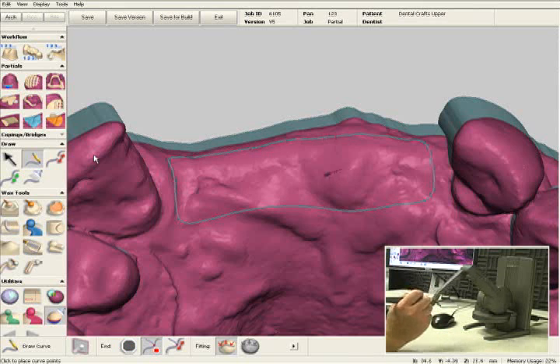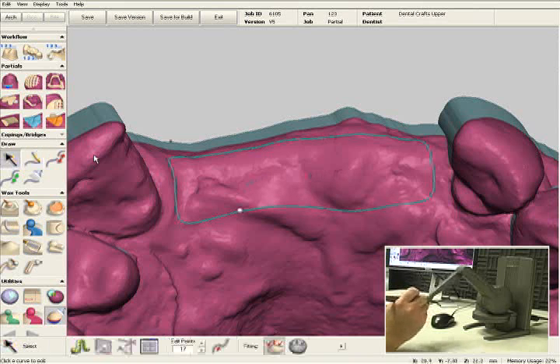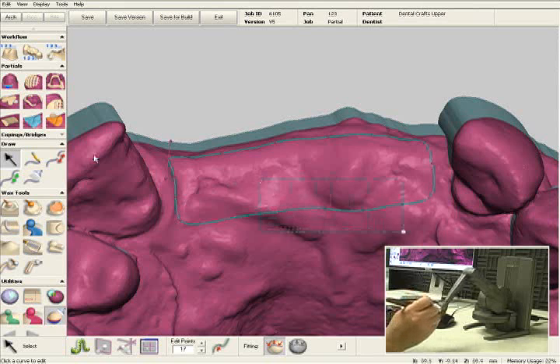If I wanted to change the shape of this outline in any way, I can click on this line and move each point one at a time, or I can select a whole row of points and move them all at once.